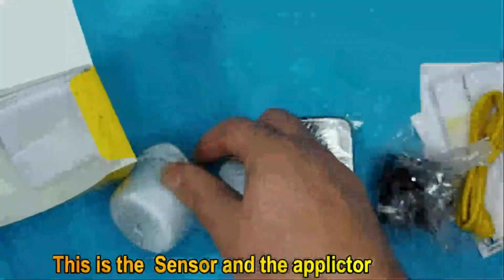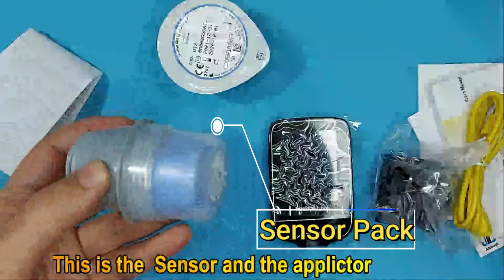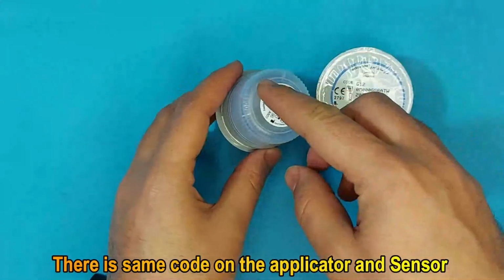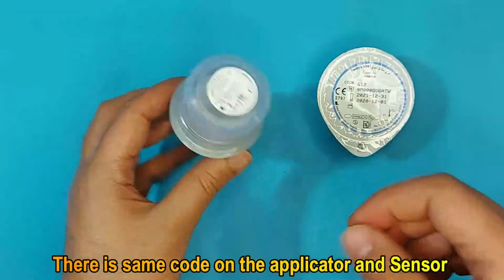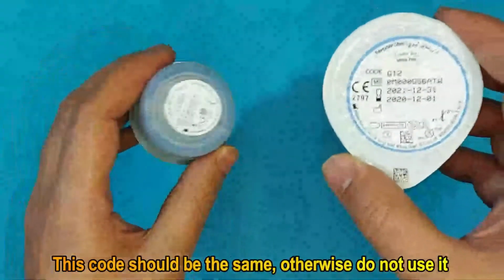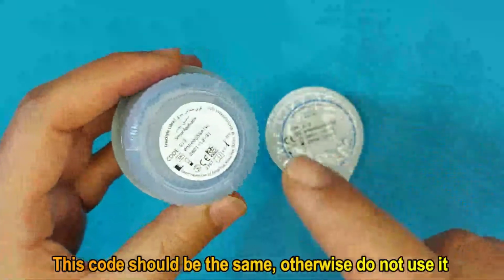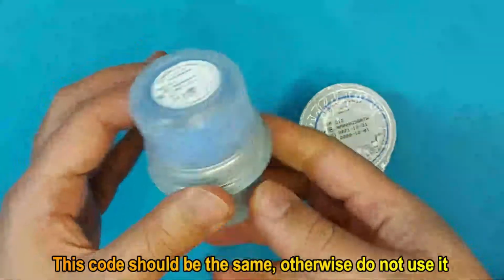This is the sensor and the applicator. This is the sensor pack, as you can see, and this is the applicator. There is the same code on the applicator and on the sensor. Before using, compare the code. If they are the same, you can use it. Otherwise, do not use that sensor and applicator. And also check the expiry of the sensor and the applicator.